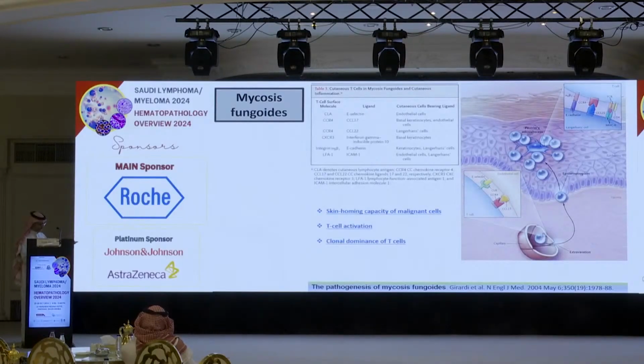So likely they are related to each other. When they infiltrate the epidermis, they infiltrate it in a systemic, organized way. They tag the dermo-epidermal junction. They go into the epidermis, forming Pautrier microabscesses, while in reactive conditions, they are a different population of T cells.